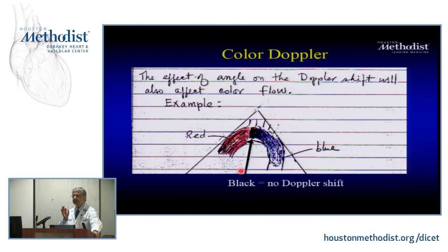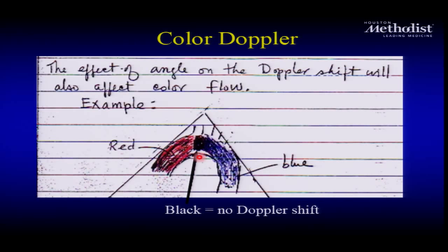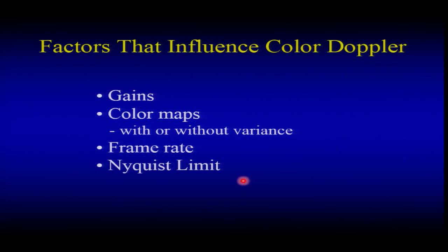Aliasing, not aliasing, a change in direction in color Doppler is blackness. Okay, how do you differentiate aliasing, going from one color to another, from a change in direction? Change in direction is basically when you have a period where you are perpendicular to the flow and the frequency shift is 0. So it's going to be dark, nothing. Here, like the ascending aorta, coming towards the transducer, perpendicular, going away, you're going to have all the shades of it, and that's how you're going to differentiate it.